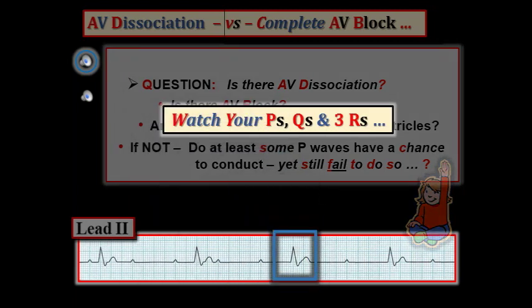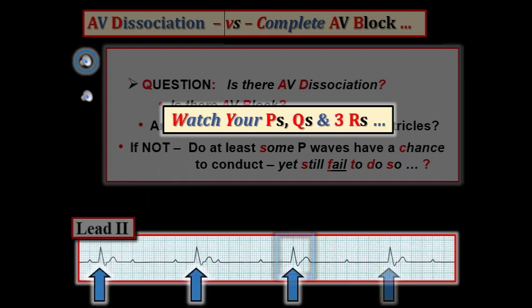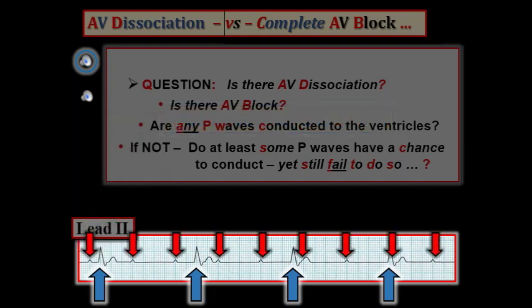The QRS complex is wide, and the ventricular rhythm is regular at a rate just over 30 per minute, blue arrows. We see regular sinus P waves throughout, red arrows, but the PR interval continually changes, red brackets. So none of these P waves are conducting, which by definition means that there is complete AV dissociation.